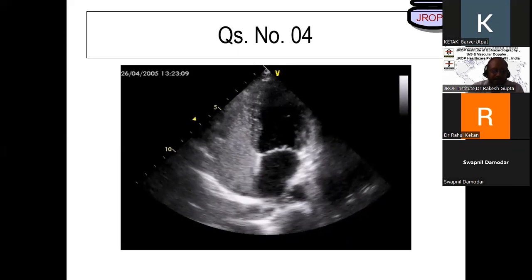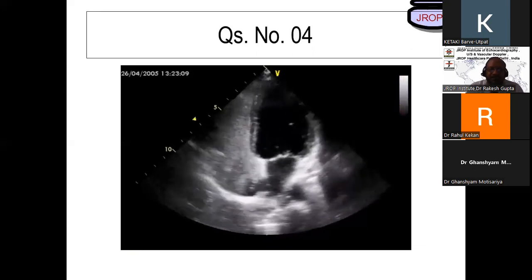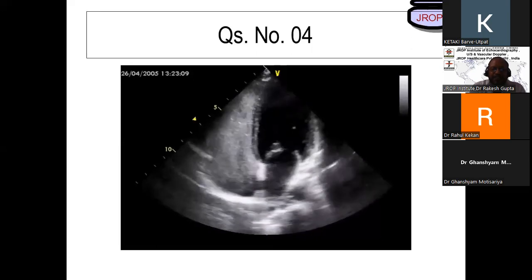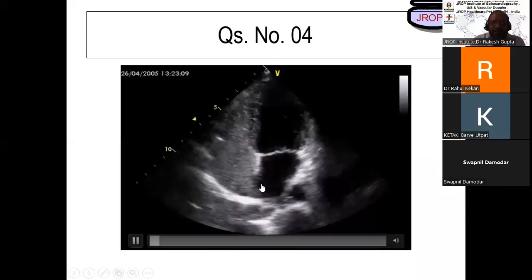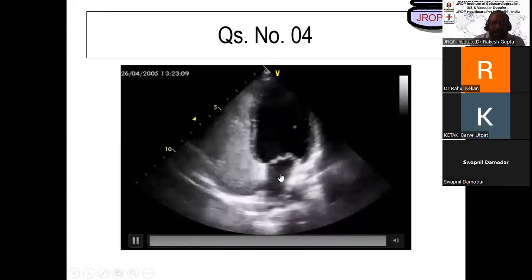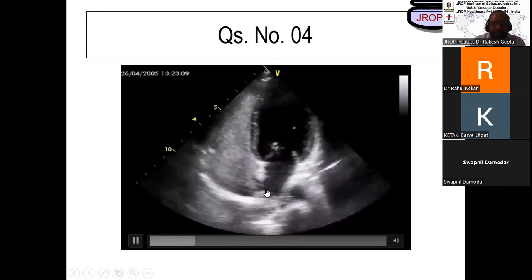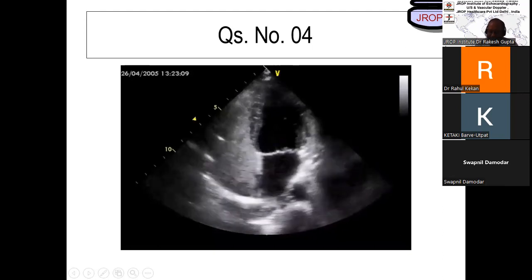Dr. Ketki, Vasudev, sir. Is the contrast getting cleared because LA blood is getting into RA, and that contrast area near the RA is getting cleared? That is perfect. That is known as negative contrast. Look at this patient. This is negative contrast over here. With every atrial contraction, you find a space out here, which is blackish in color. Yes, sir. Perfect. That is known as negative contrast.